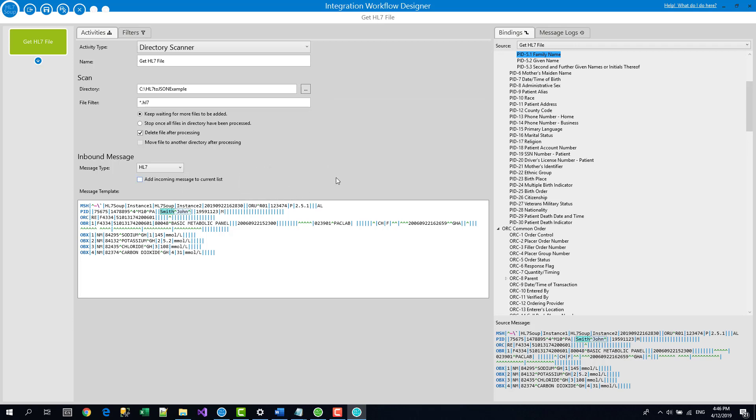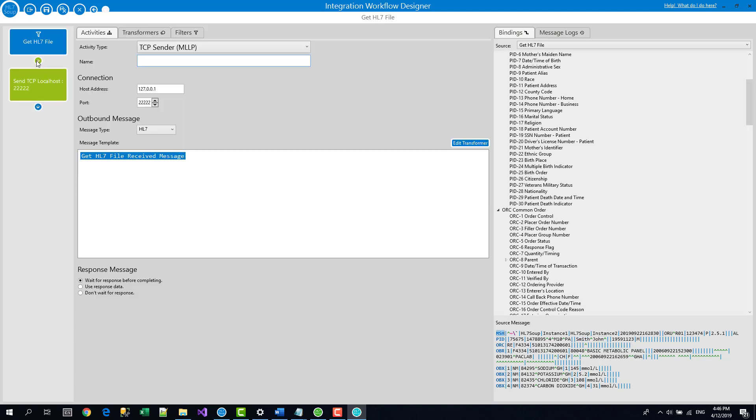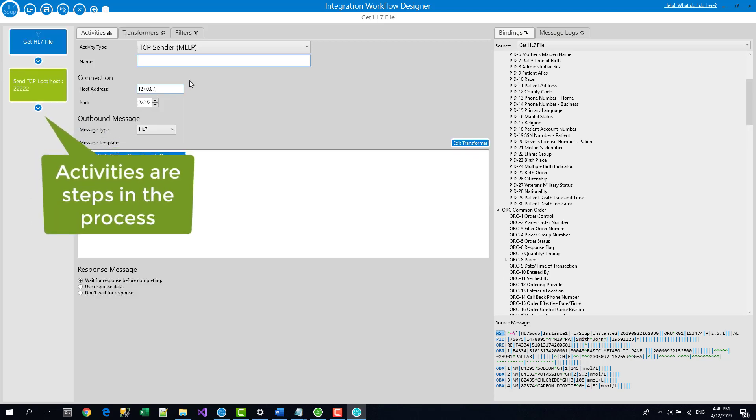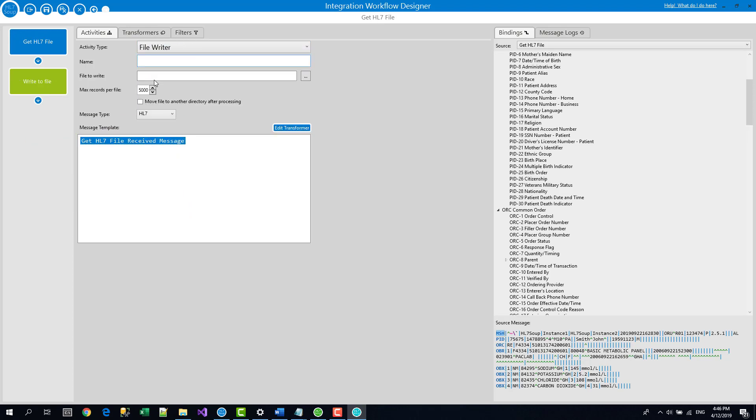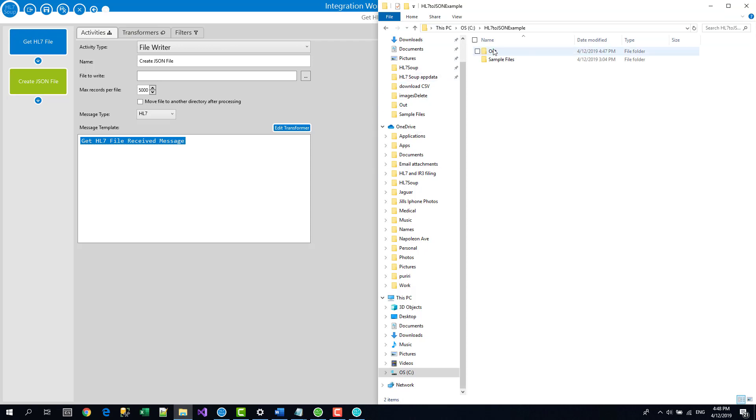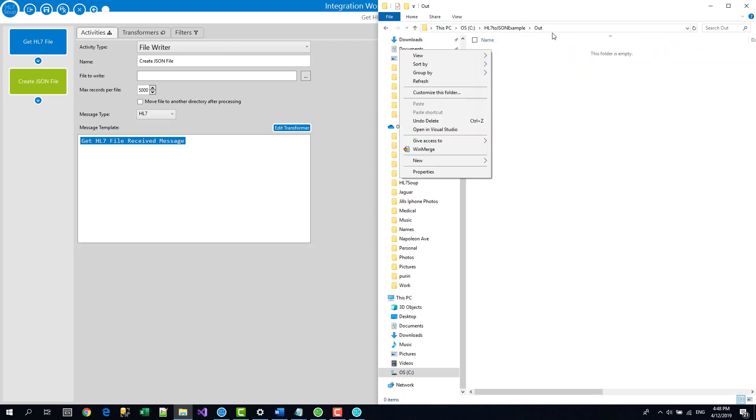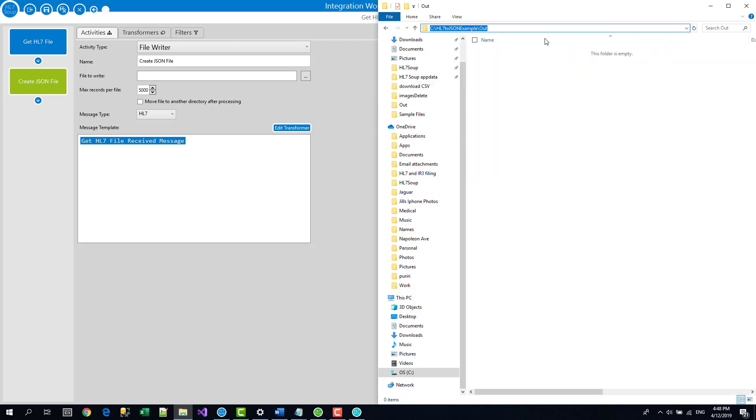Okay, so right now we have the message coming in, we need to write it to another directory. So I add another activity and we're going to make this a file writer as well. I'll call this create JSON file and so now I have to give it a file name and path. I want to write it out to this out directory.